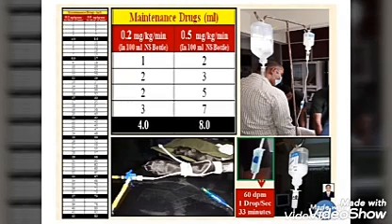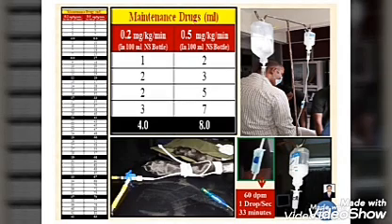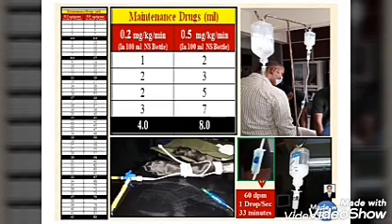So this slide shows how to set the CRI of propofol at the dose rate of 0.5 milligram per kg per minute. This slide is helpful for setting the rate of the CRI for the propofol.